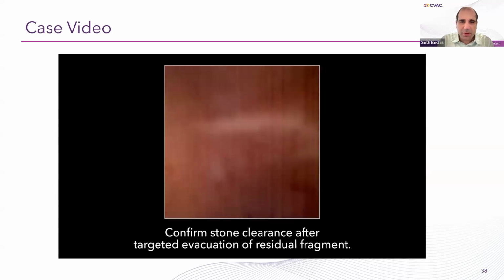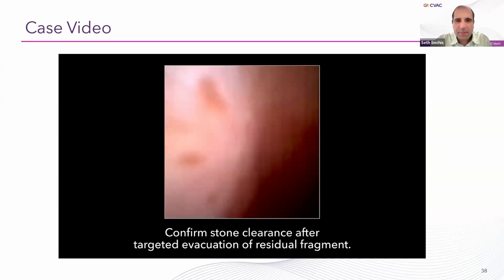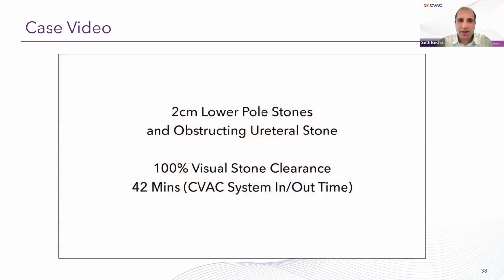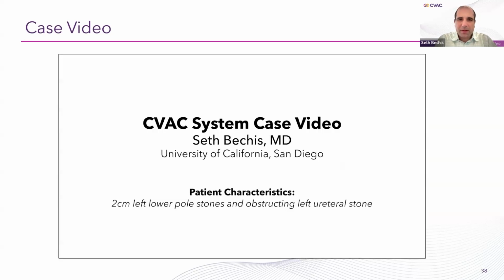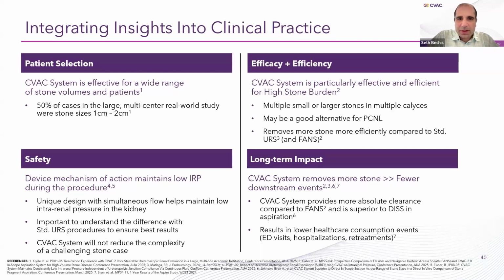And I think taking that extra time to either dust or pop dust your stones so that they are less than 2 millimeter fragment sizes, it's worth the time up front, because then if you do it correctly and you don't have any stones hiding that are larger than that, when you do your aspiration, you're done. You don't have to put the laser back in. I think that's always a hard part, is having to put your laser fiber back in for those fragments that you uncover. And in this patient, she had a 6-week CT scan postoperatively and was completely stone free. So big win for her. I have to say this is one of the larger stones I had treated, and it went really well. Total ureteroscopic time was 42 minutes.